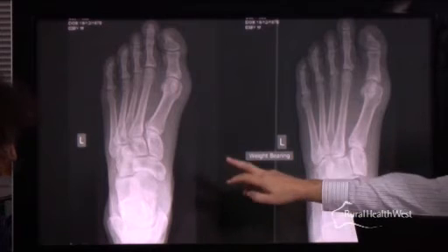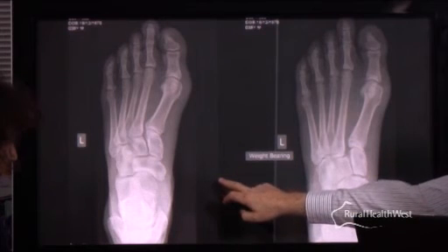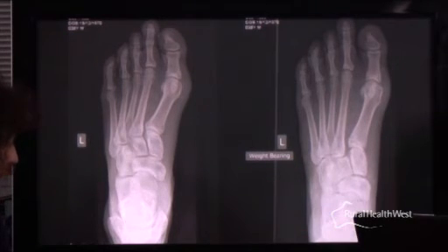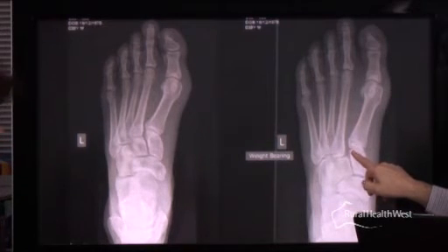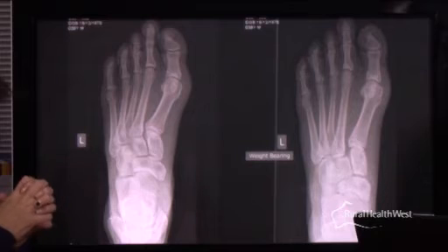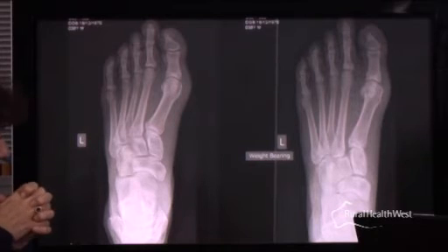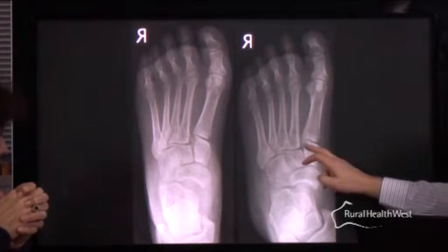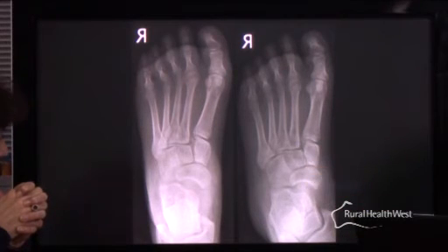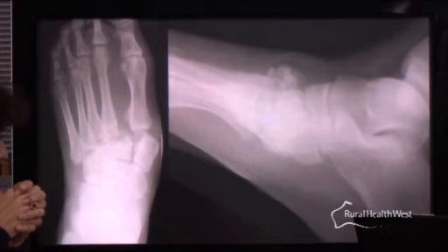This is another patient which is normal when they're non-weight bearing, but if we know that there's a question of a Lisfranc ligament injury, you get them to weight bear and you can see that it opens up. So when they actually stress that ligament, it's abnormal. So if we know that that is a concern, then we would do that. And so these are like little flakes which you may or may not see with Lisfranc fractures where they've been avulsed. And then the question is, well, does it really matter?